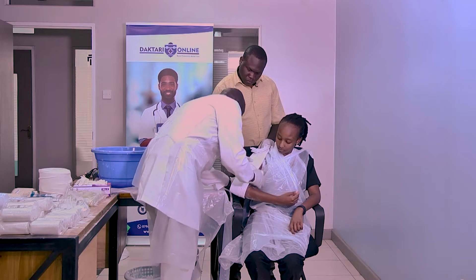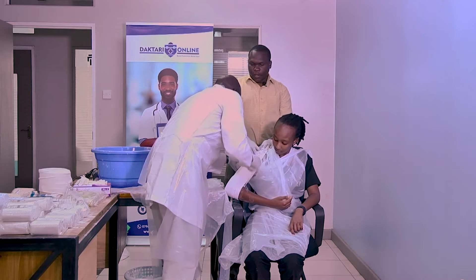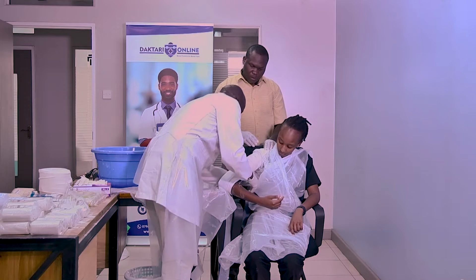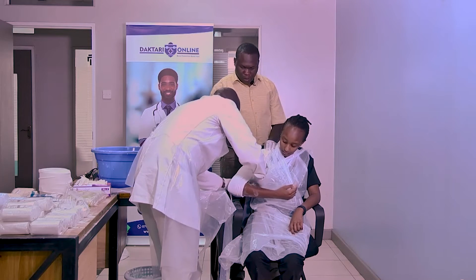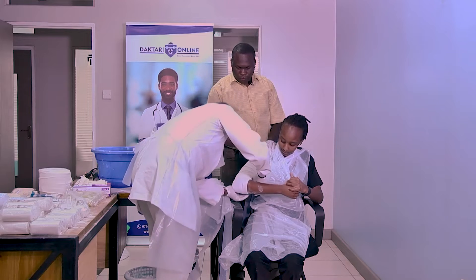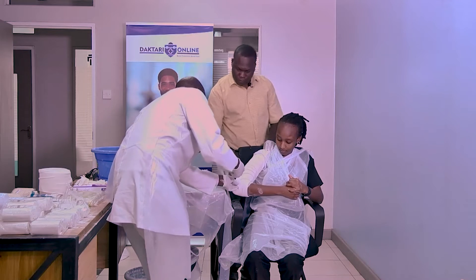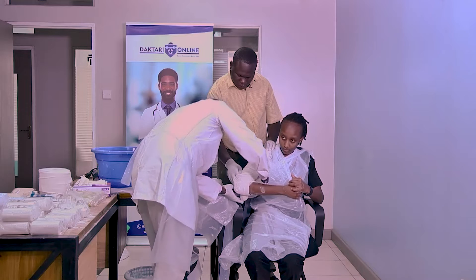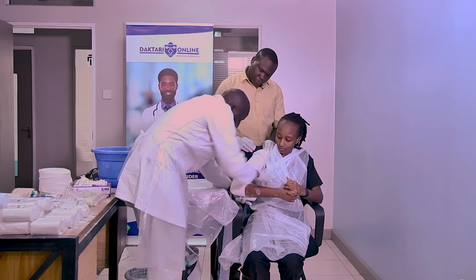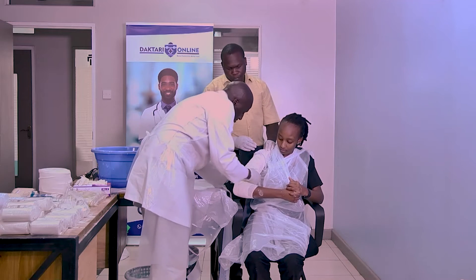For the first roll of the bandage, don't tie it. Start from the fracture site, distal to proximal — those are the principles to always remember. The patient can also help by holding here. Secure with your crepe bandage. At the elbow, you have to be very, very careful, because this is the area where if you put too much pressure, the patient can come back with a lot of swelling. Make sure you are very careful when applying around the elbow joint.